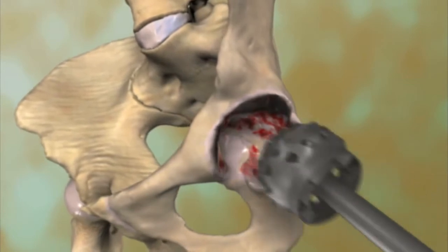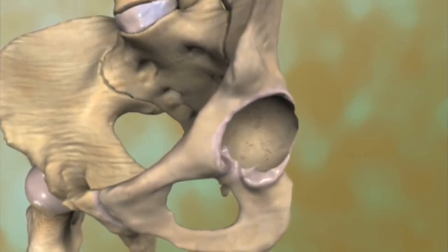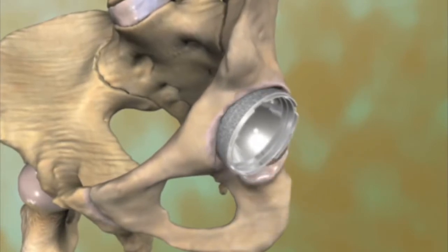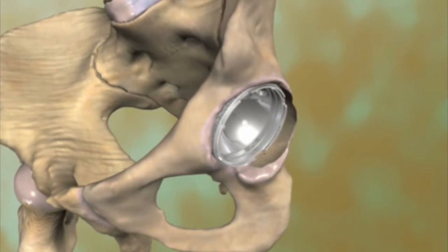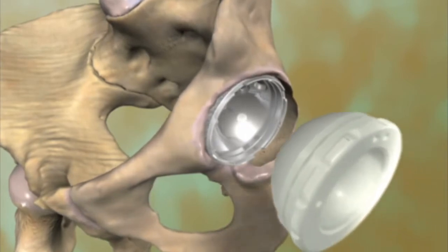A tool called a reamer is used to prepare the acetabulum to receive the socket portion of the hip replacement. This metal and plastic combination is called the acetabular component and is fitted into the newly reamed bone surface. The outer metal part of this component, sometimes called a cup, fits directly into the socket.